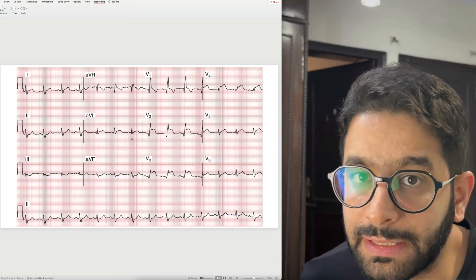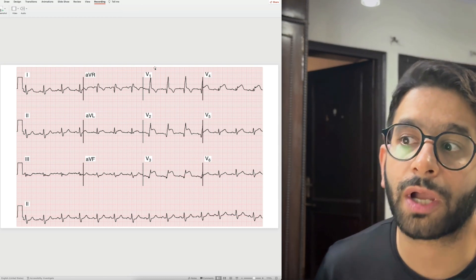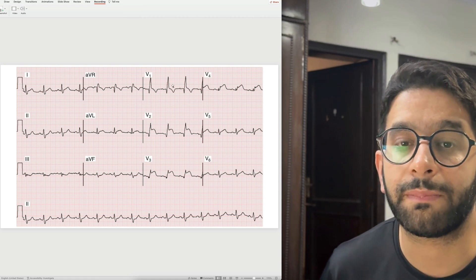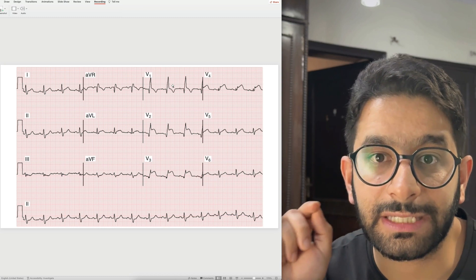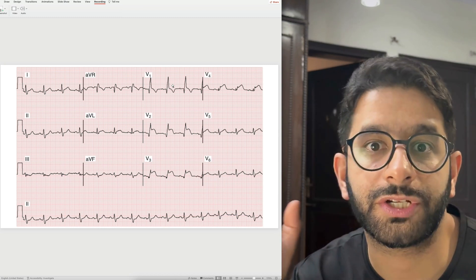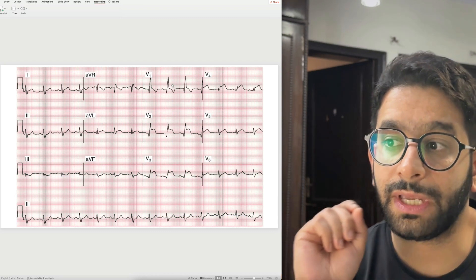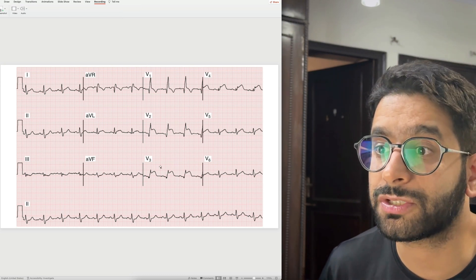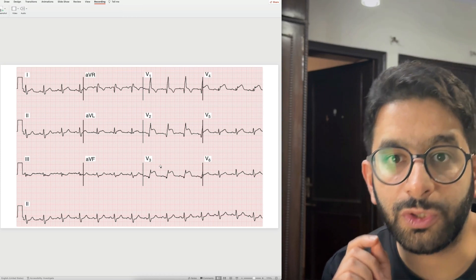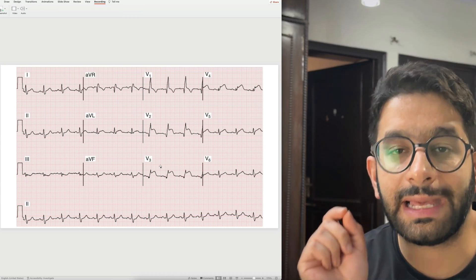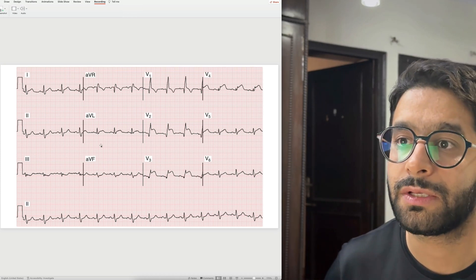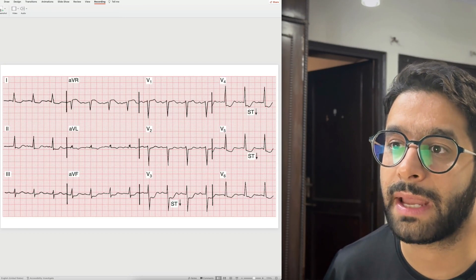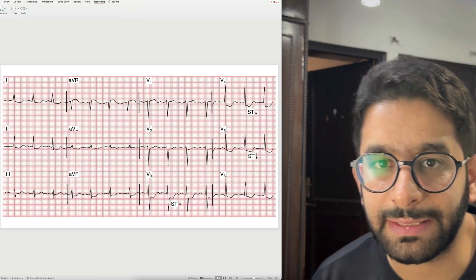An important tip: if in a case of anterior wall MI you find a right bundle branch block, it means it's a high-risk case — it means the patient has had a large infarction and is at risk of death. Right bundle branch block in the setting of anterior wall MI indicates an extremely high-risk patient. Usually when we do angiography in these patients, a very proximal LAD is occluded — the most important vessel in the heart.